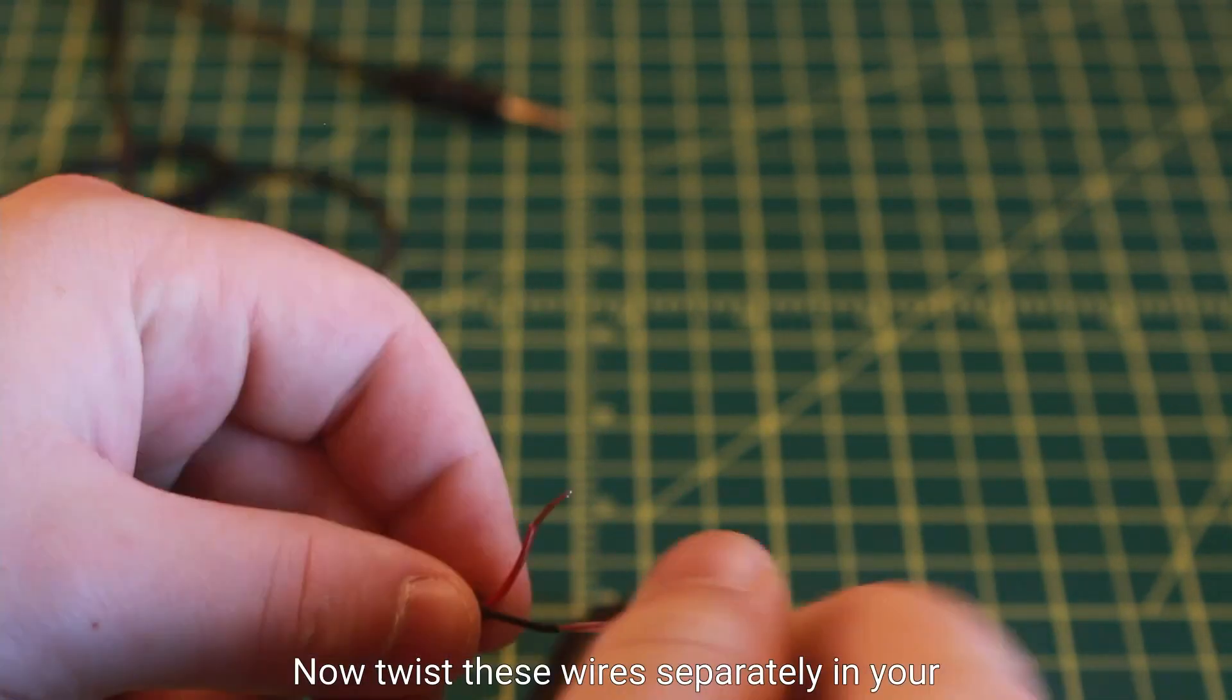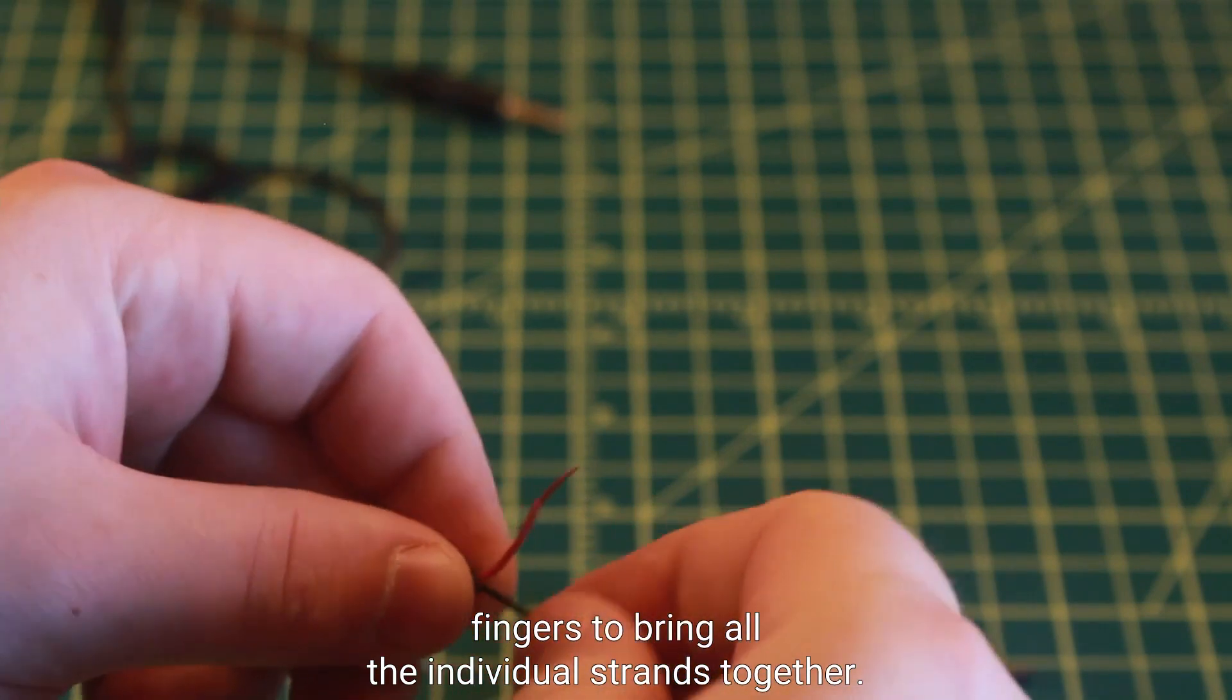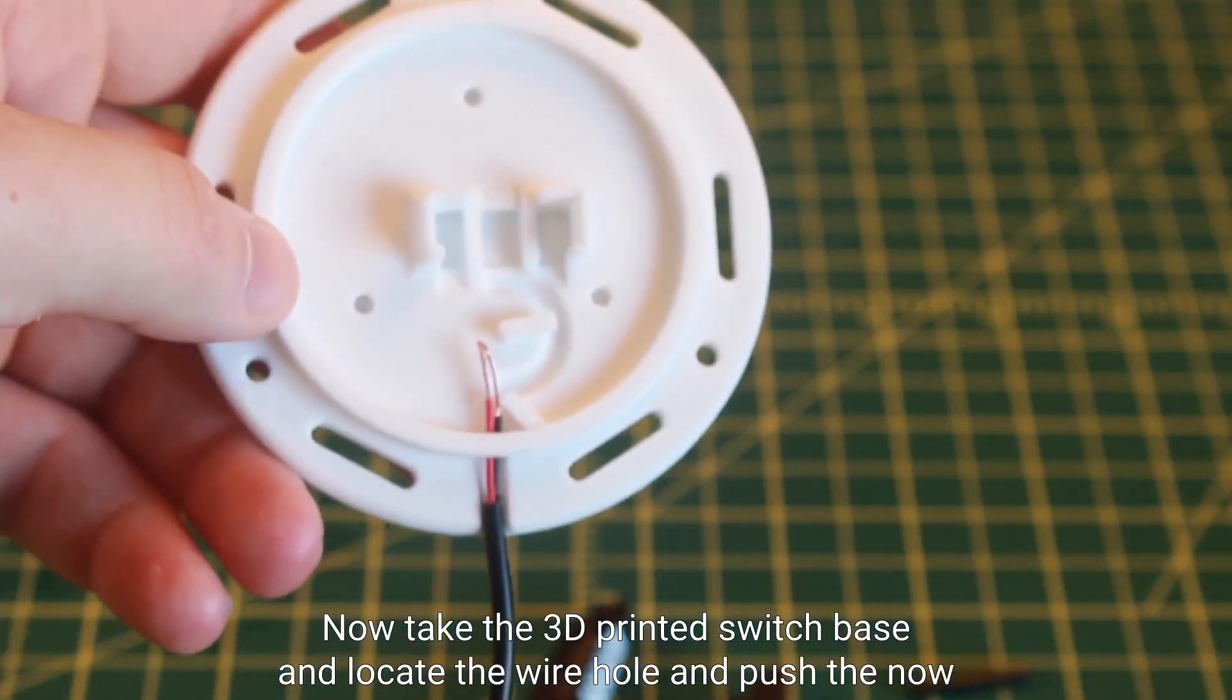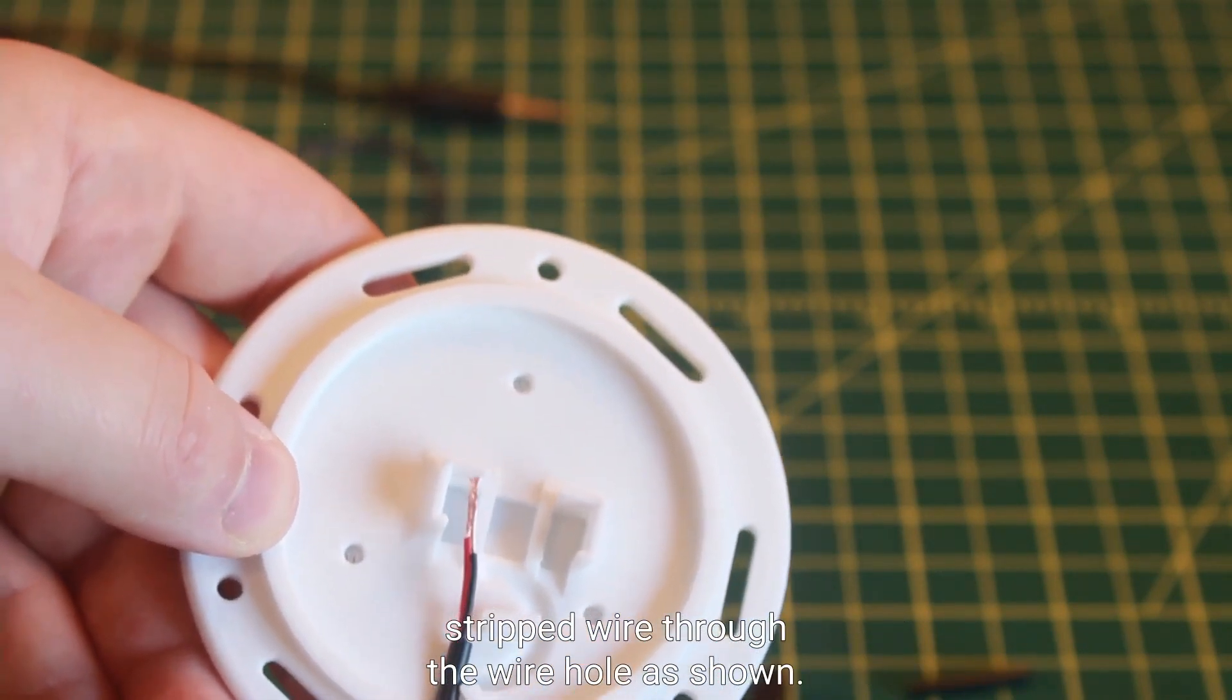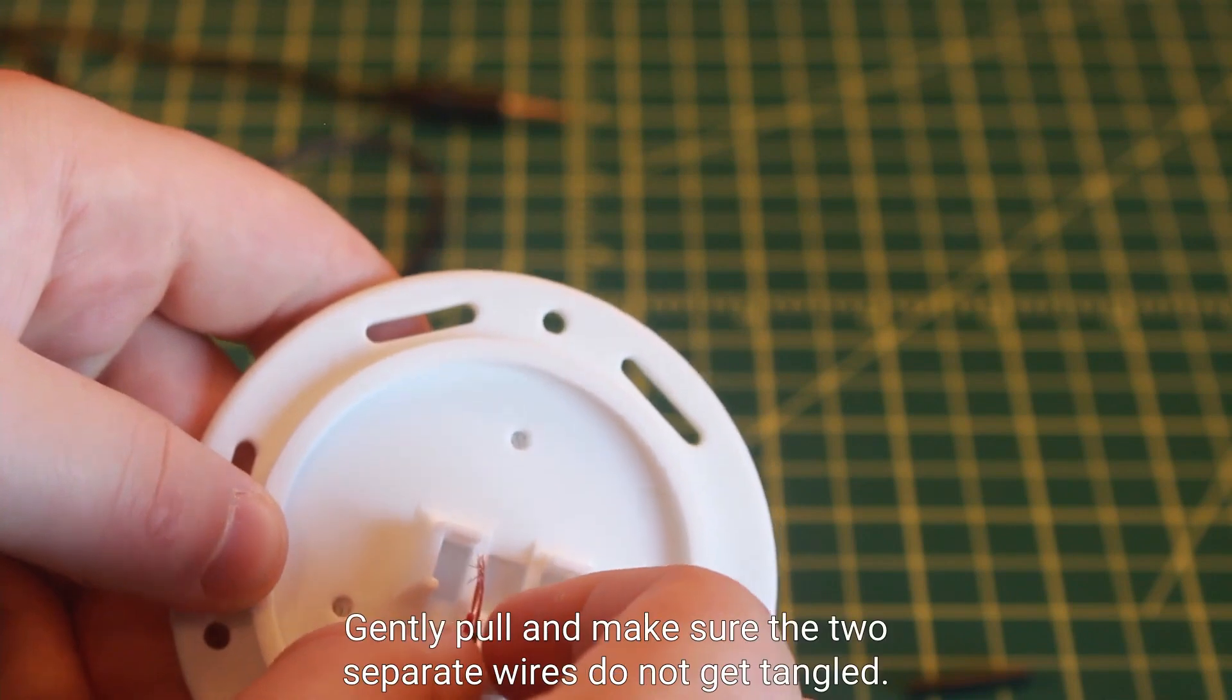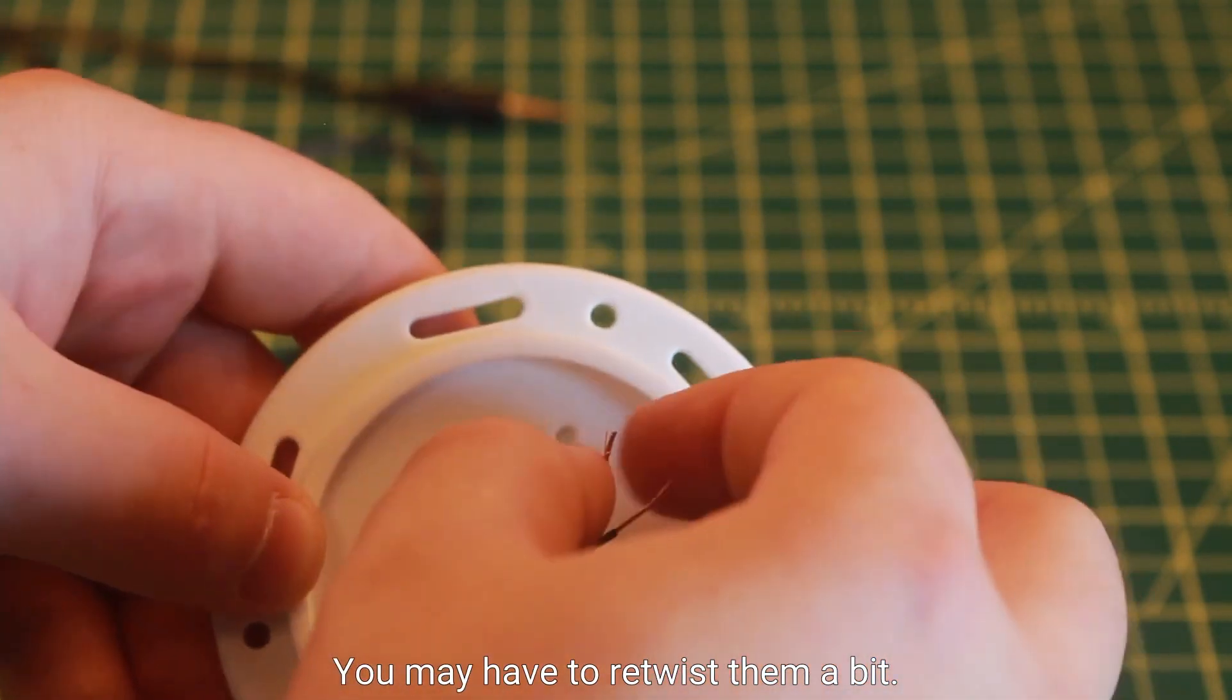Now twist these wires separately in your fingers to bring all the individual strands together. Now take the 3D printed switch base and locate the wire hole and push the now stripped wire through the wire hole as shown. Gently pull and make sure the two separate wires do not get tangled. You may have to retwist them a bit.